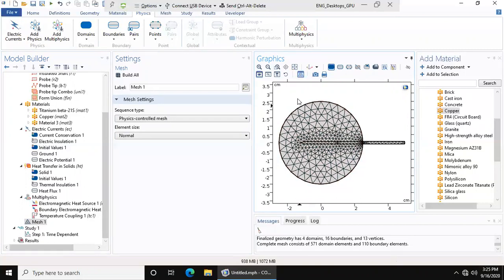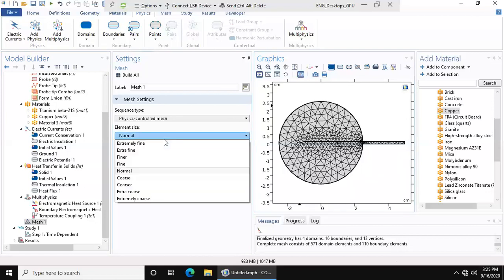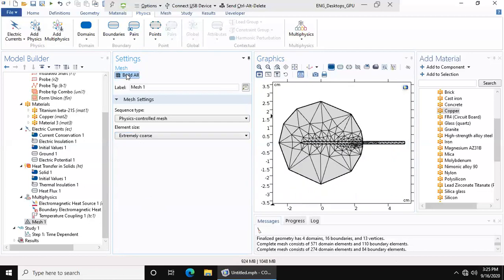If you have a very coarse mesh size, like this, you aren't going to be getting good data on the fringes because you aren't solving the equation for a long distance, so it's going to be less accurate.